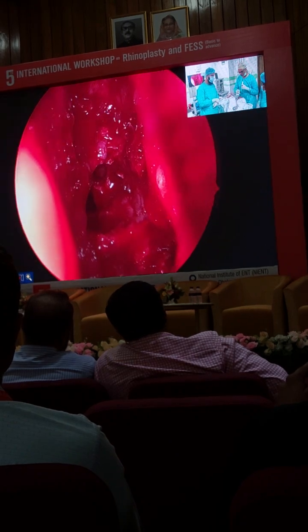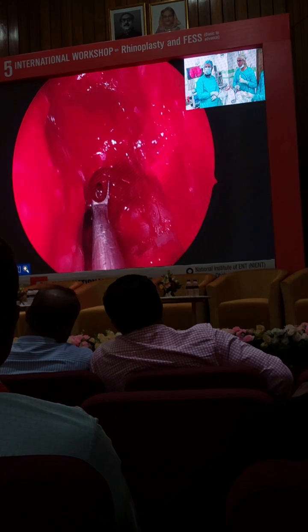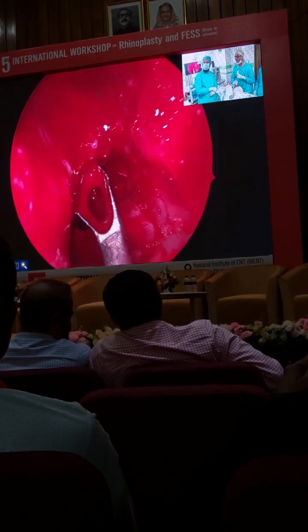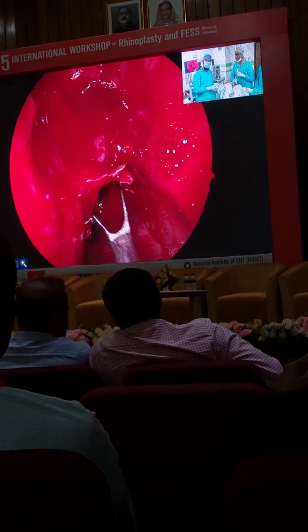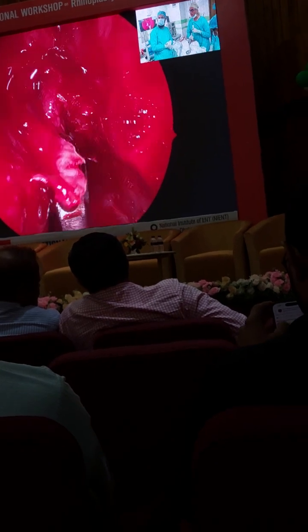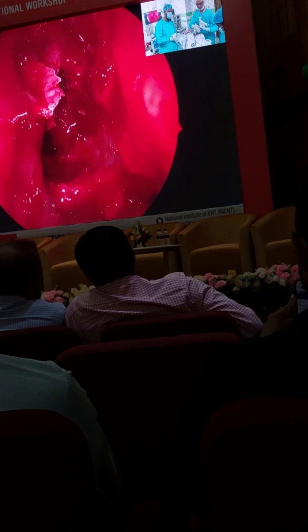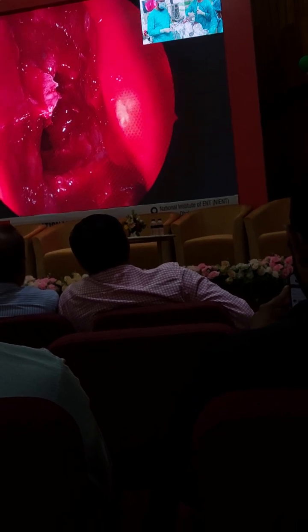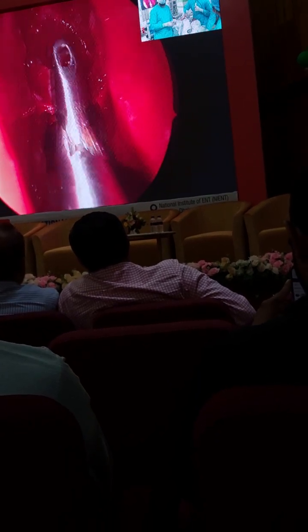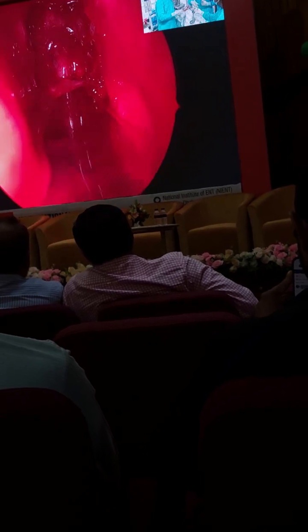So would you please show us the first olfactory neuron area? I hope not. Okay, so you saw that's the cell that was waiting to be removed. Now once I get this out, I'll see the skull base. Upward. Okay, bone comes out.